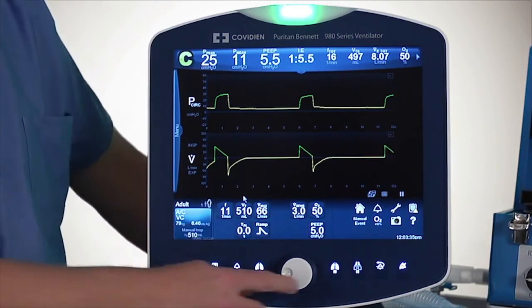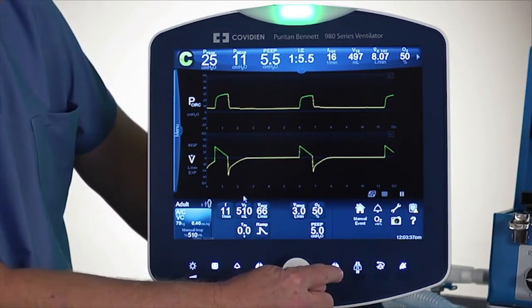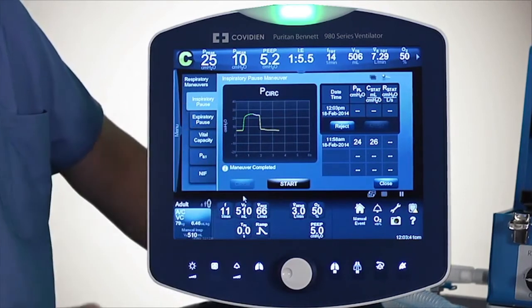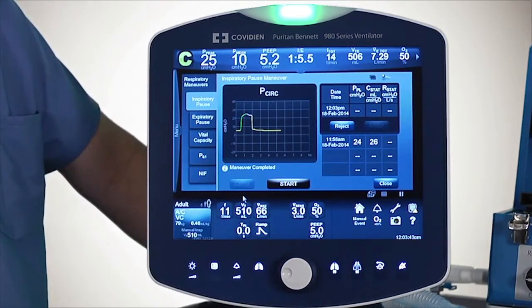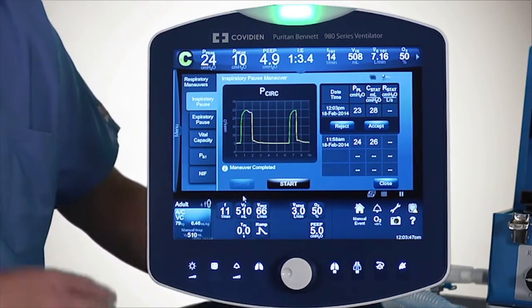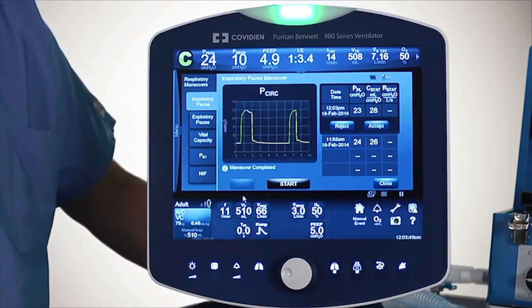On the other side of the knob is the inspiratory mechanics maneuver. If I just touch that button, it does an inspiratory pause by itself. We realize that many times you do this as a routine during your ventilator check, so we wanted to make it a direct access key.